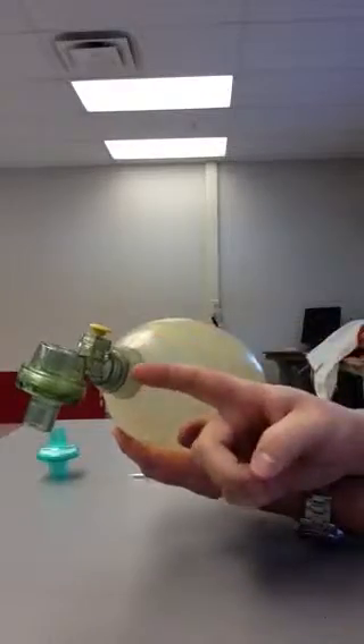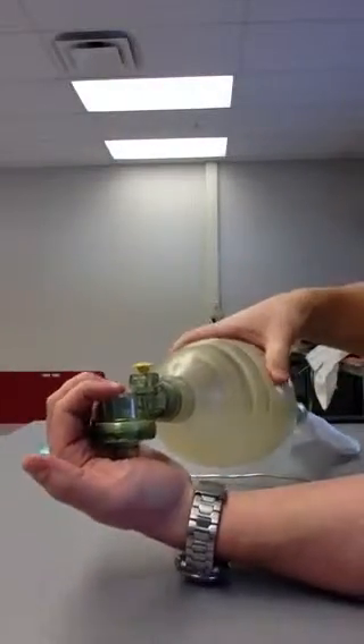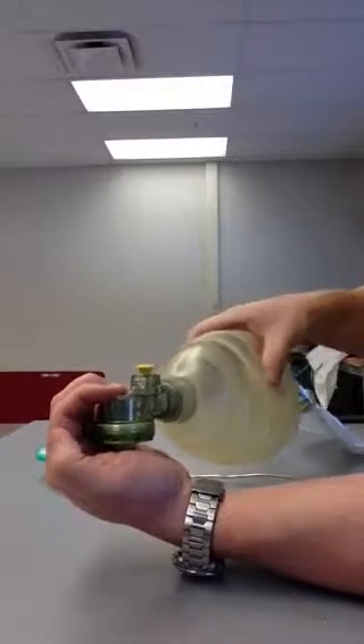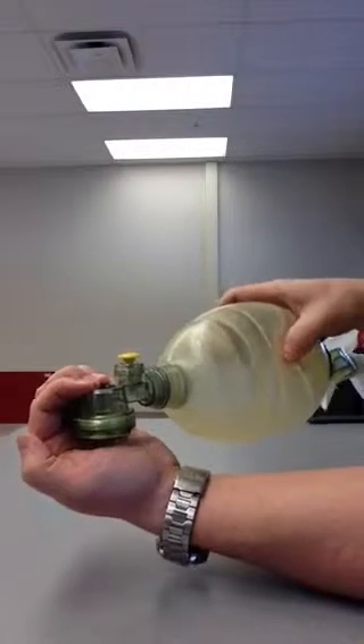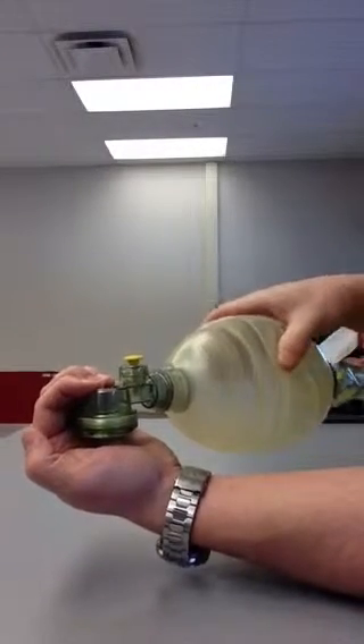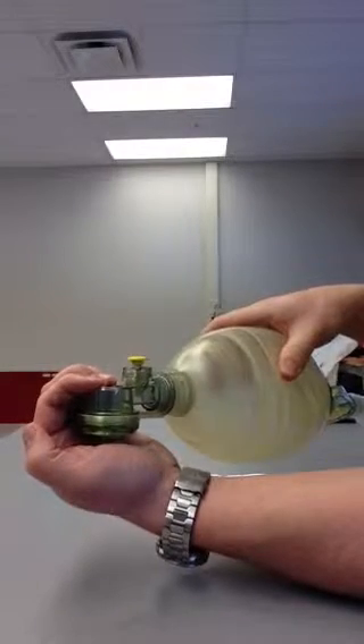Second test: check that inspiratory pop-off. Occlude the patient connection, squeeze the bag with substantial force, and check that pop-off. See if it's holding pressure too. Try not to make the pop-off go — see what it feels like, how the compliance of the bag is, and that'll give you an idea once you're bagging too.